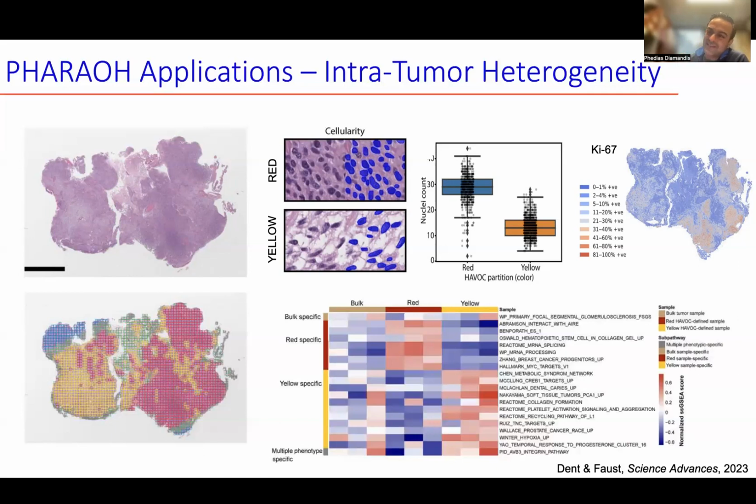We've also microdissected these areas, and what we find is that the molecular signatures of these areas are quite different. So in the red area, as expected by the Ki-67, we get these MYC pro-proliferative signatures, a lot of undifferentiated stem cell signatures, whereas in the more loose and less cellular areas, we see different signatures, largely related to hypoxia, infiltration and invasion, ECM protein deposition.